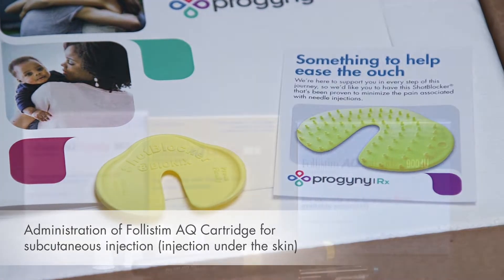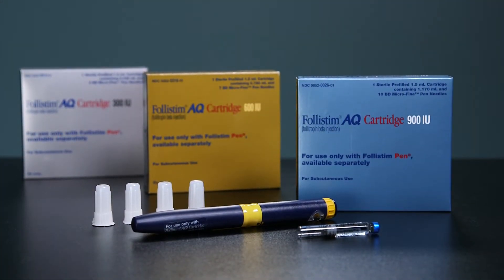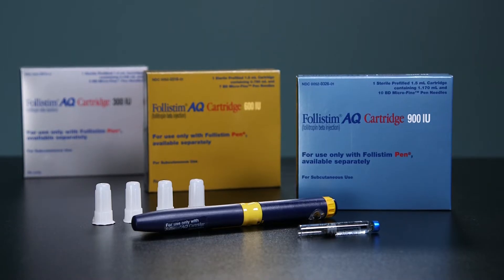This video will review the administration of Follistim AQ cartridge. Follistim AQ cartridge comes in individual cartridges and a reusable pen.